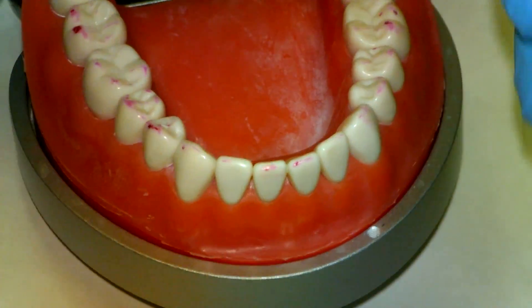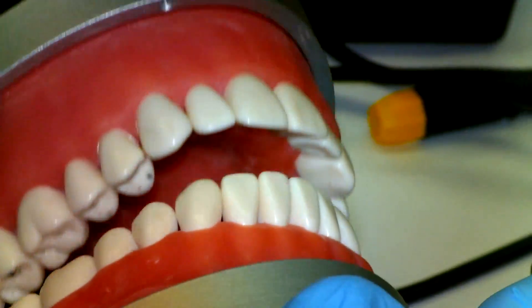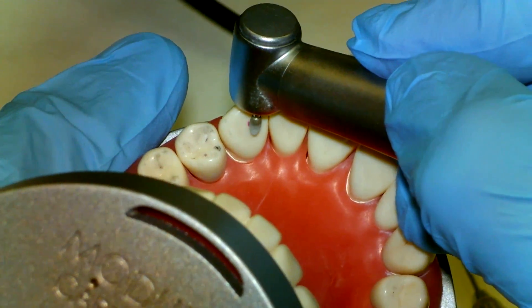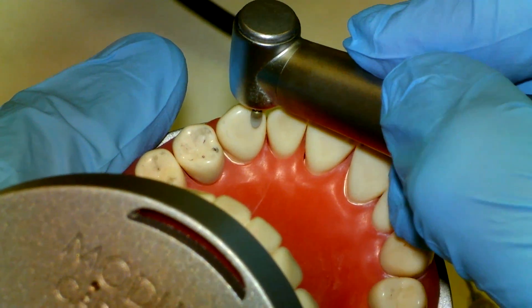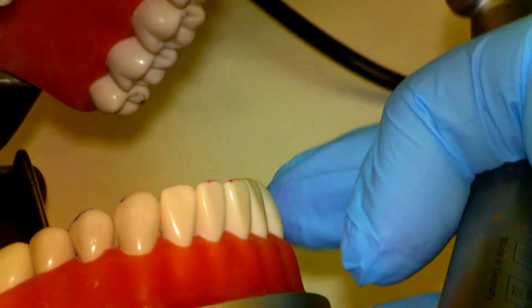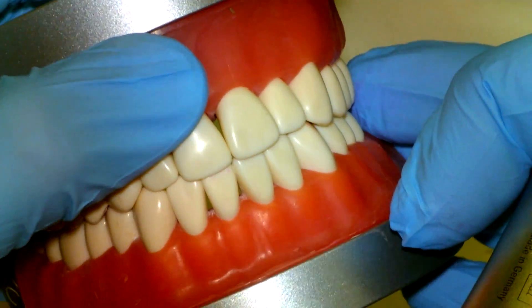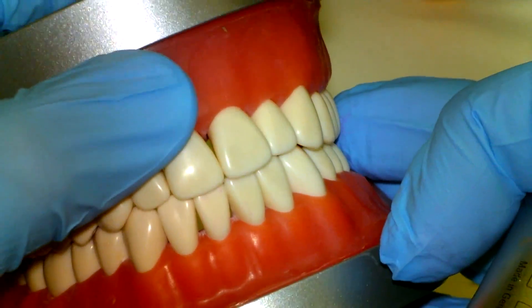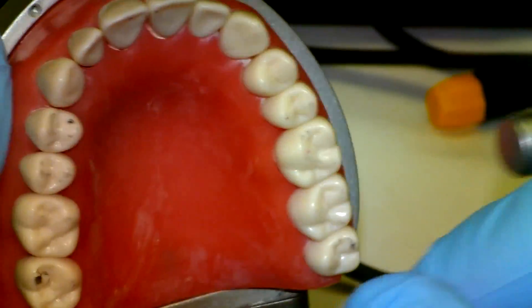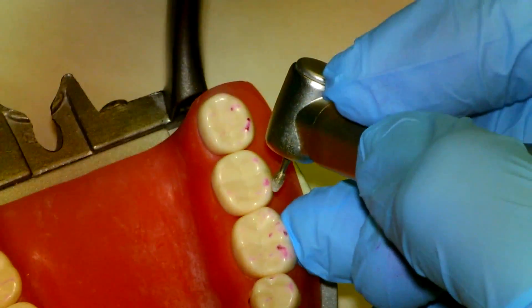We don't want to adjust any of the anteriors yet. At some point they are going to come into contact, and we'd rather adjust the lingual surfaces of the maxillary anteriors so that we don't alter the incisal edge position of the mandibular teeth. Remember, that can affect speech because our 's' sounds occur when we have a little bit of space between our maxillary and mandibular teeth. We'll go ahead and quickly go through these adjustments.